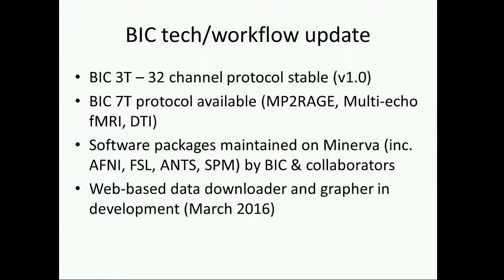In addition, we are ramping up the 7T BIC protocol, which is in some sense even more exciting than the BIC 3T protocol because it makes 7T imaging accessible, which historically has been hard for a lot of places. So now we have standardized sequences.